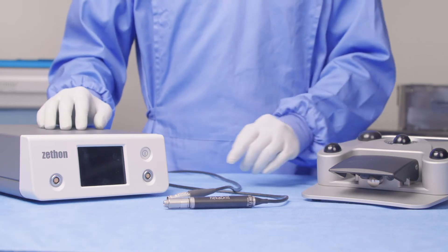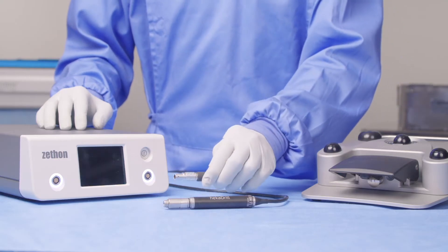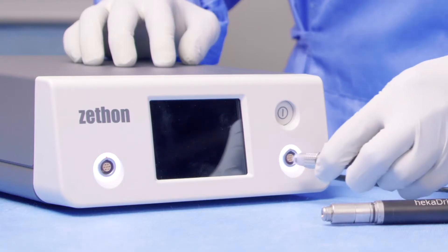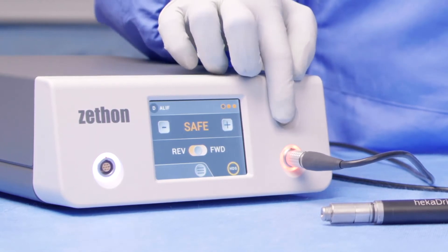Firstly, you want to begin by turning your console on. Once the system starts up, you can take the cable that's attached to your handpiece and connect the red dot on the cable to the red dot on the console. You will notice the tool starts up in safe mode, indicated by the orange light.